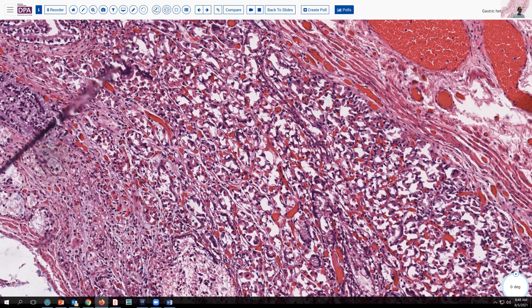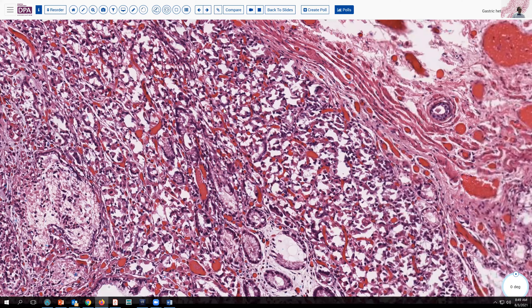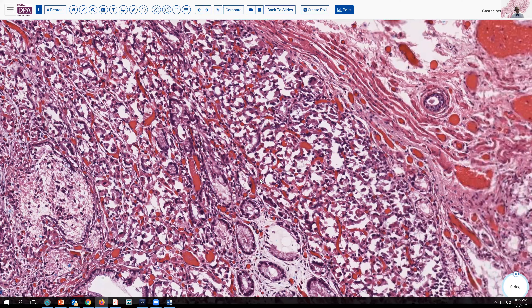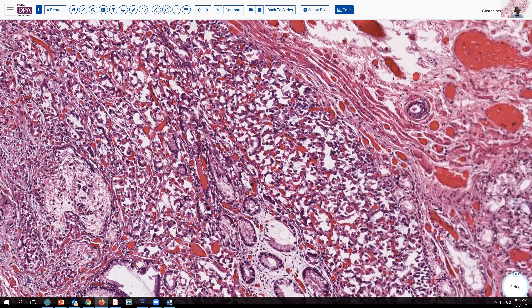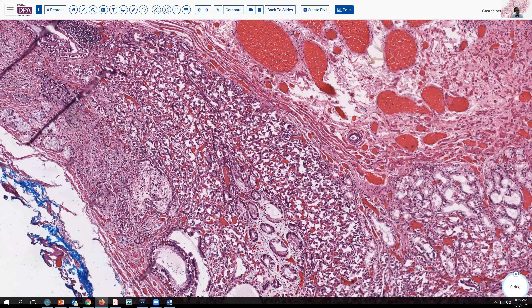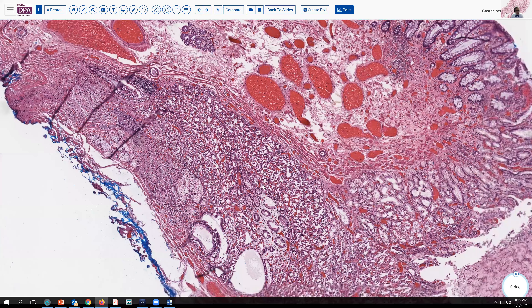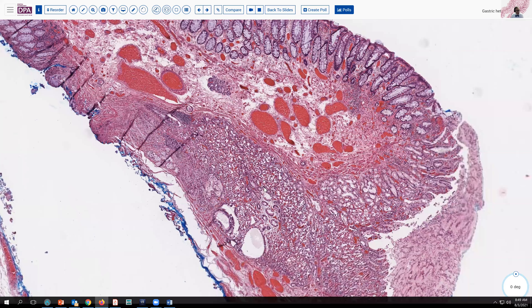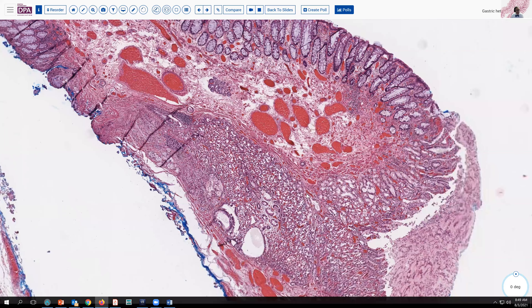Additional sections also showed this quite clearly, despite some cautery artifact. So this is an example, then, of ectopic gastric-type mucosa occurring in the colon.